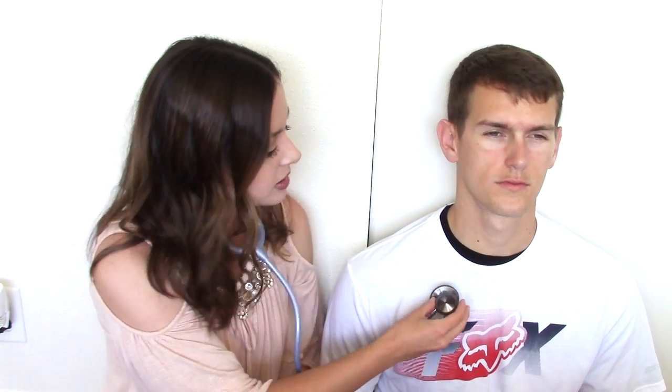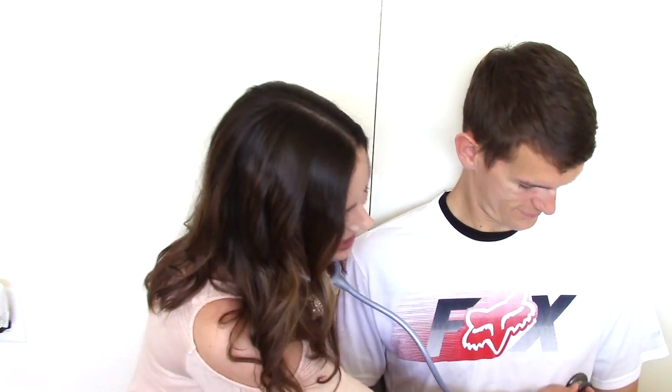Now if you have a patient who is not able to easily turn to their side or sit up so you can listen to their back, you can listen to the front — it's not necessarily as clear or accurate, but you can do that. Basically you're going to do the same thing: start at the top around the second intercostal space, have them take a deep breath, then go to the middle, and then down to the bases of their lungs, having them take deep breaths in and out all the way down. You're listening for things like clear lung sounds, crackles, rhonchi, wheezes, or diminished lung sounds — anything that is outside a normal lung sound.